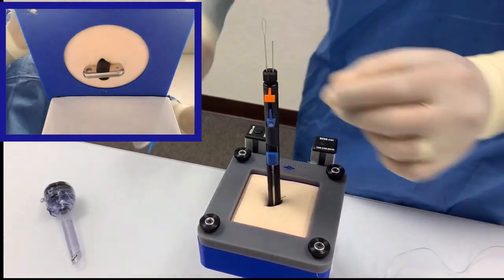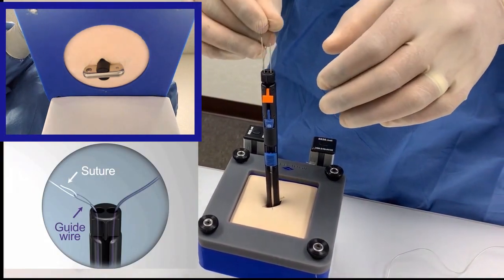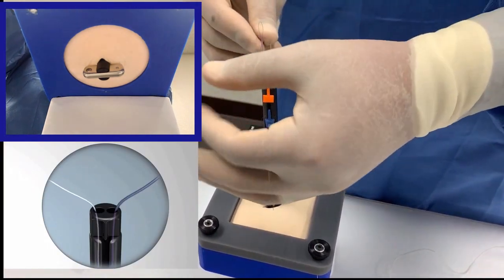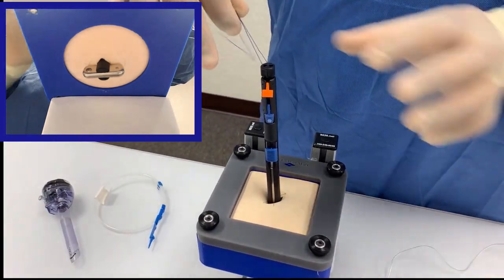Remove the blue advancer, then insert approximately 2 to 3 inches of the suture material through the loop and pull the guide wire tip completely out, bringing the loop suture out from the other side.